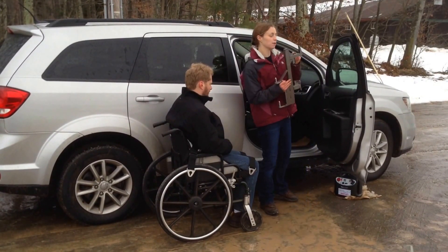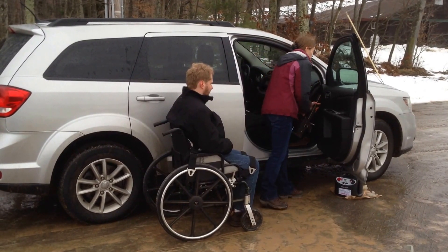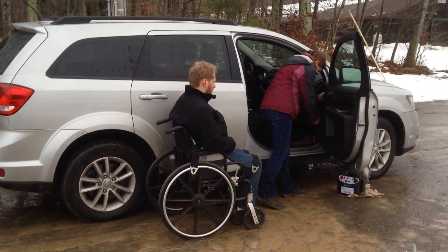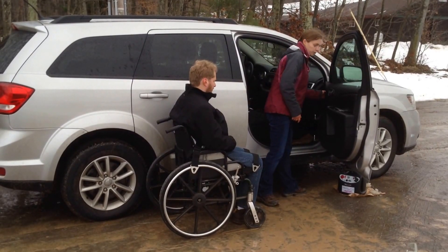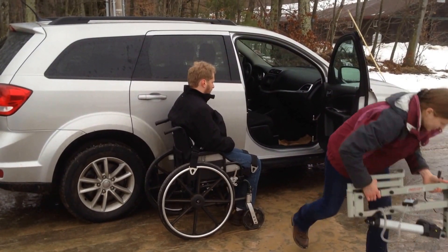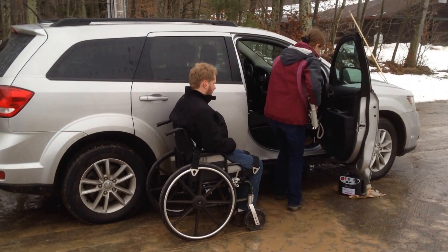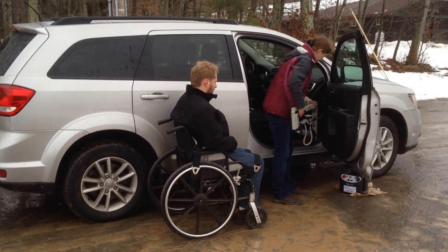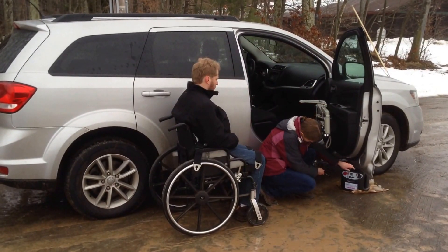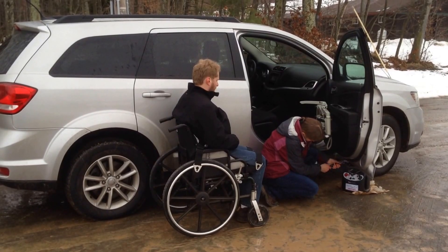This speedy bar has an upward hooking bracket, which means it's going under the top hinge and then over the bottom. When you can't push it, pull it, or wiggle it, it's in the right place. I'm going to take the lift assembly — this just goes on the pins. We're using a portable battery pack, so no modification to the vehicle is required.